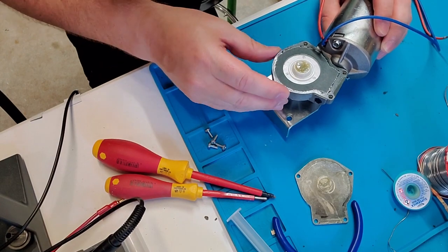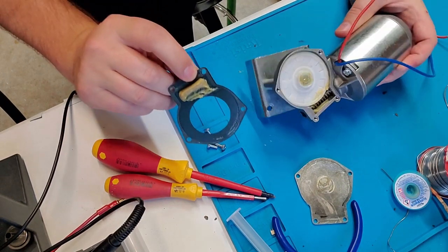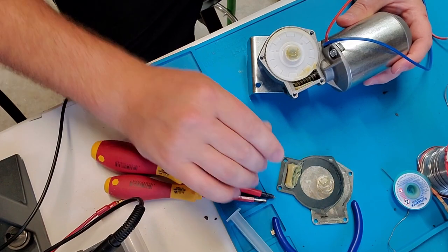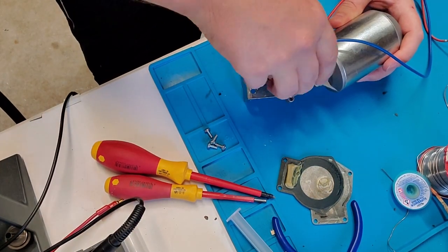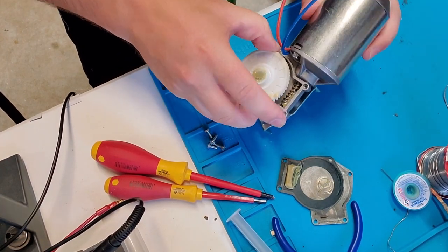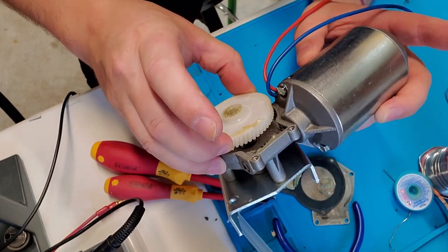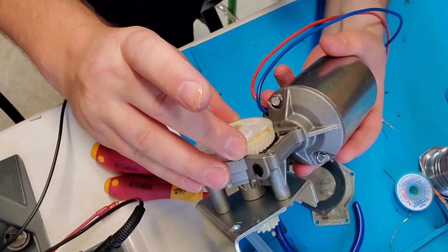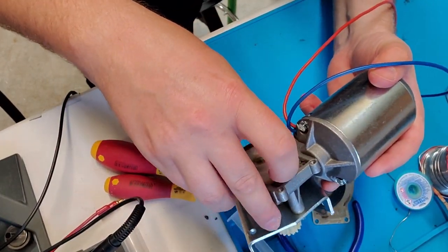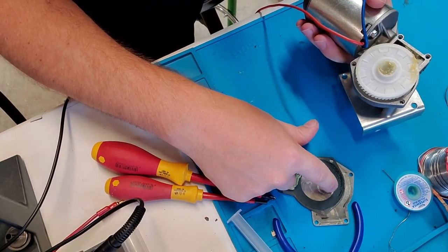Okay, so I've got a gasket here on the back. Pretty nice one. Okay, well, the grease still looks good. That's positive. And let's see, I've got a large nylon gear, which goes into a worm drive. You can see the worm gear up in there. See how it interfaces with this nylon gear here? It just slides in. There's no preload or anything. Normally, on this type of assembly, you'd probably see a spring or something as a preload. Nope, nothing of the sort.